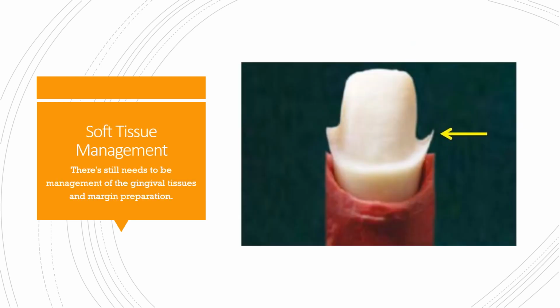Talk about soft tissue management. So most crown preparations involve replacing old restorations. So the digital imaging needs to capture the margins in approximately 0.5 millimeters of tooth apical to those margins. Some form of gingival retraction is still going to be needed, and good isolation is required, which is no different than traditional dentistry, right?